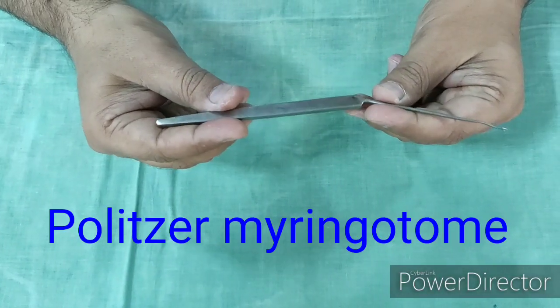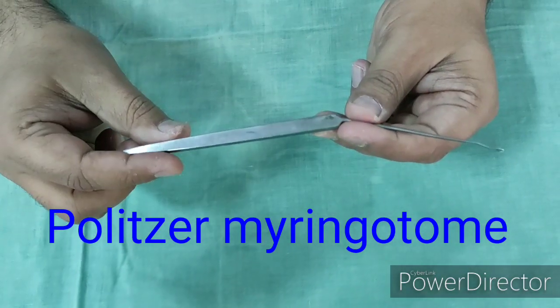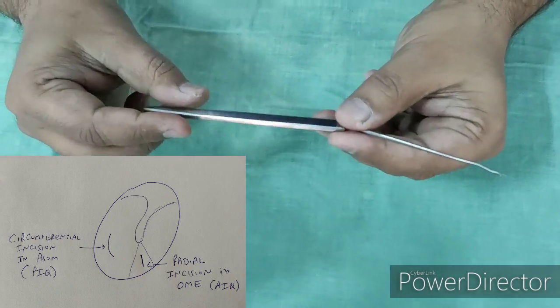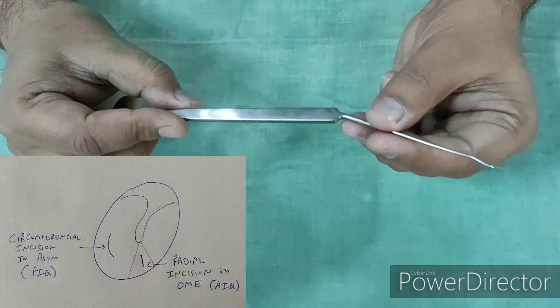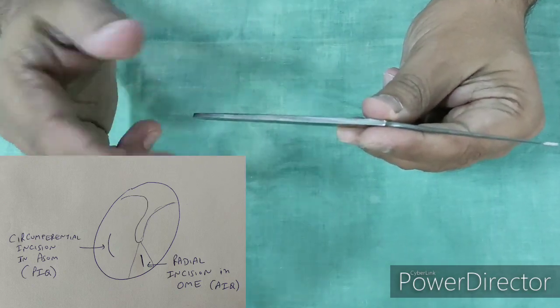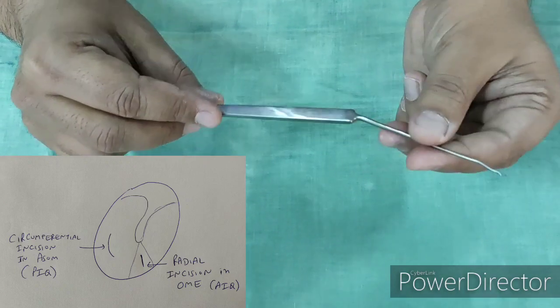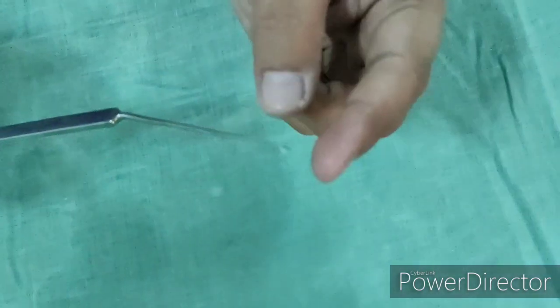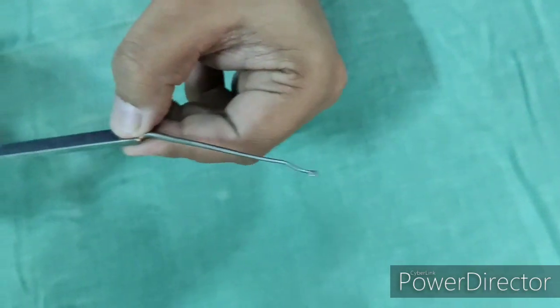This instrument is Politzer's Myringotome. Myringotomy is a procedure in which we put an incision in the tympanic membrane to drain middle ear fluid. The two most common indications are: first, acute suppurative otitis media, in which a circumferential incision is placed in the posterior inferior quadrant; and more commonly in children, otitis media with effusion, in which a radial incision is placed in the anterior inferior quadrant. This is a bayonet-shaped curved instrument, and through its tip the incision is made over the tympanic membrane.